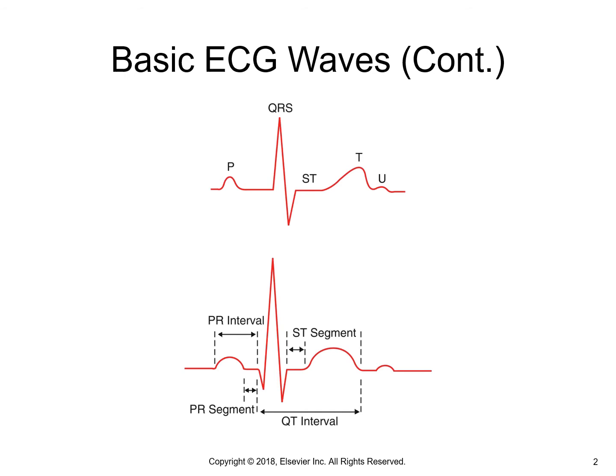Moving forward, I just want to start off with this slide again as a basic review of the EKG waveform. Okay, so again, your P wave, you should know by now, hopefully from the previous lecture, is your atrial depolarization. So when your atria are contracting, that's your blip from your atrial squeeze basically.